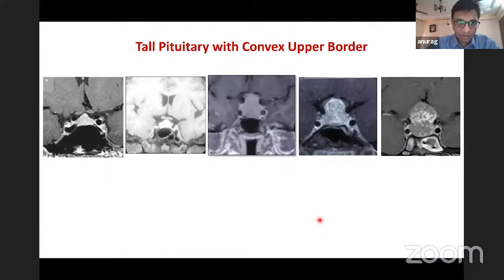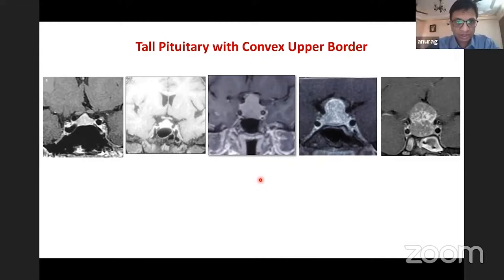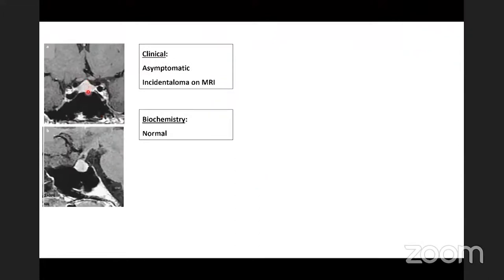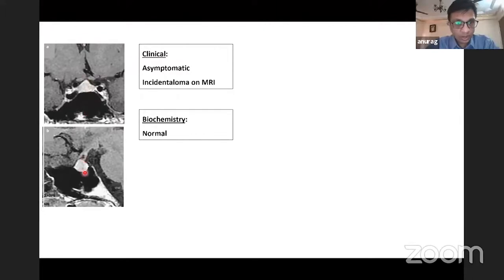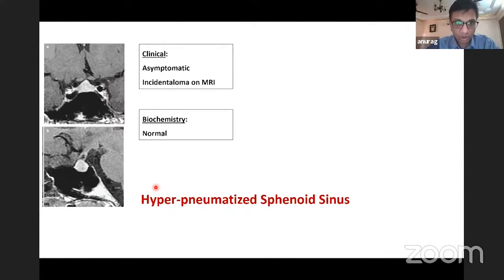In this image I've shown five different patients, and most of them look like hyperplasias, but only two of them are actually hyperplastic pituitary gland. We have to differentiate hyperplasias from other etiologies. In one young child, everything else was normal and he was on lower centiles. When we looked at the sphenoid sinus, it was hyperpneumatized — hyperpneumatized sinus can give an apparently larger pituitary size.